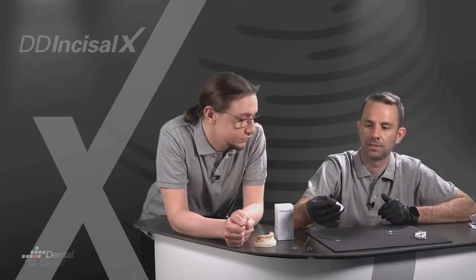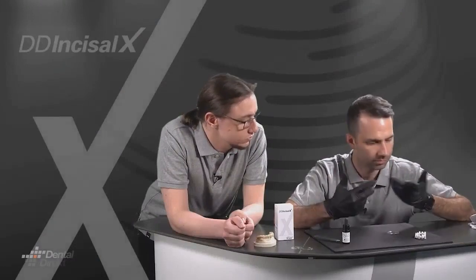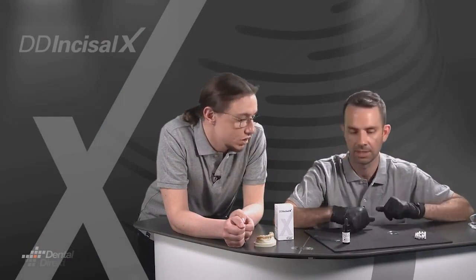Yes, it is very important that we definitely shake the bottle first, not only the Incisal X, but always shake well the other liquids as well, the art elements, including the other liquids. Exactly, we have to shake very well. We want an even application of paint, and that's how we can ensure it. Precisely. And then of course, before I open the bottle, we have to mention gloves. We need them for zircon anyway, we already know that. Yes, we don't want any fat on it. Yes, and then later we would only have color problems, we definitely have to avoid that.